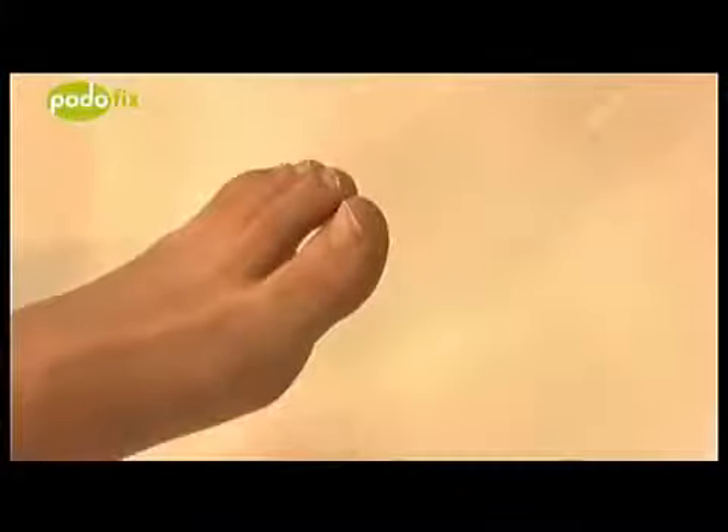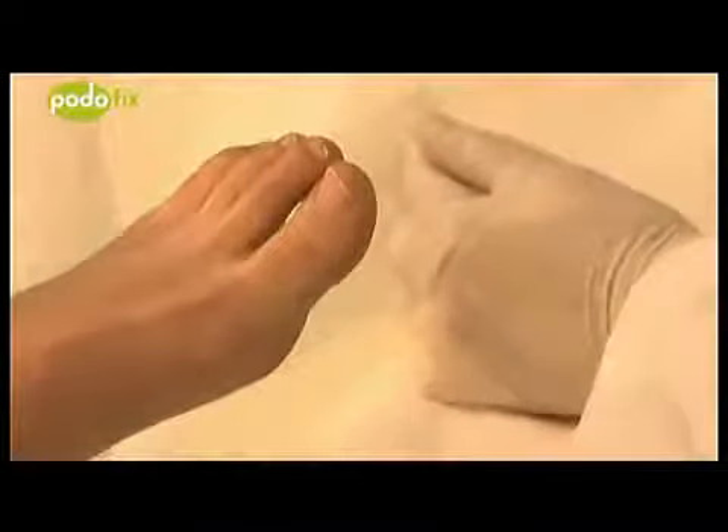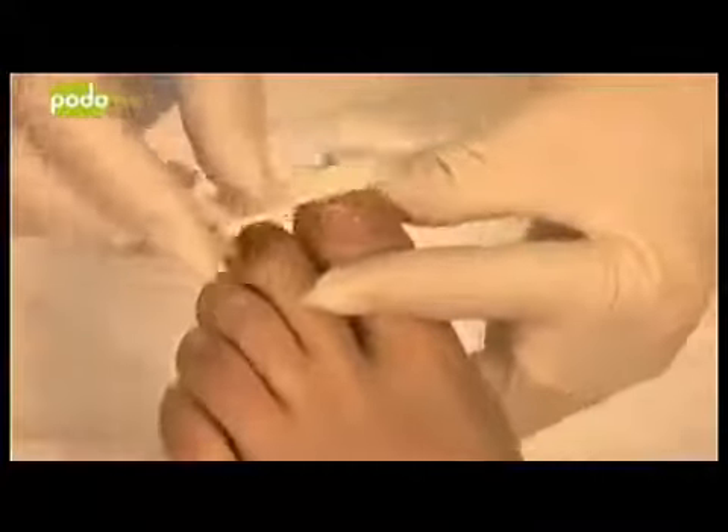The nail area is disinfected, but note that the nail should not be softened before using the brace — avoid foot baths and callous softeners before use. The nail must, before adhering the brace, have the smoothest and most flat surface possible. If required, a milling device or a soft nail file is used to smooth the nail surface or grind it down a bit, and any loose parts of the nail are removed.